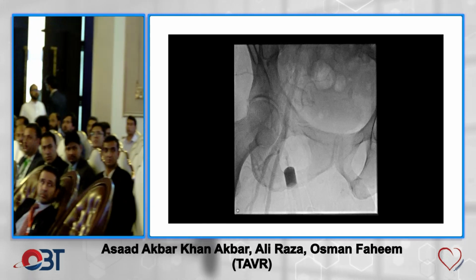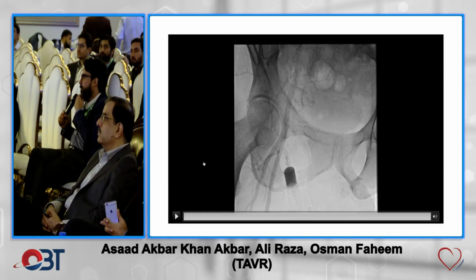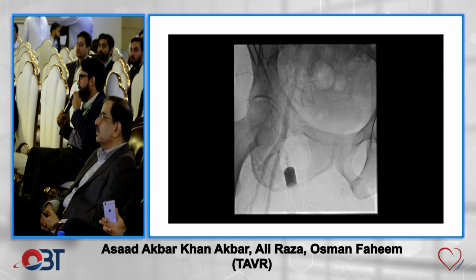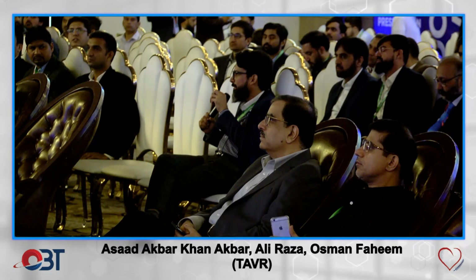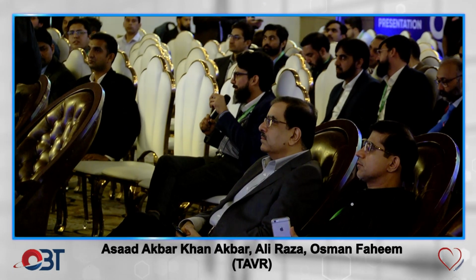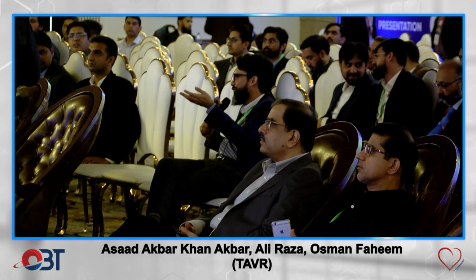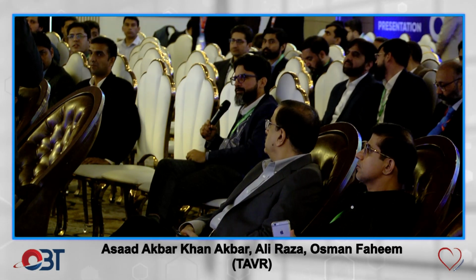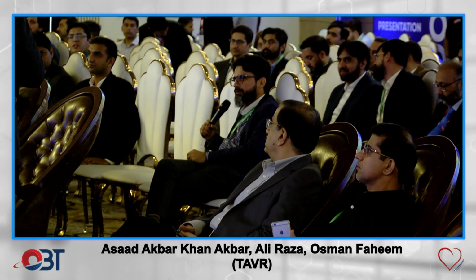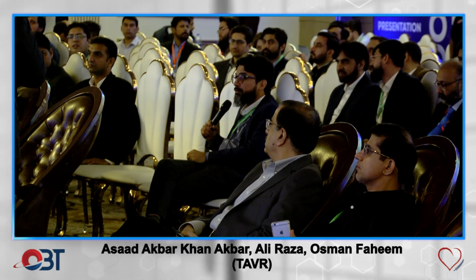Yeah. And a shortcut to micropuncture is to use your radial access sheath. Okay, your radial access needle, use that. Yeah. That's a lot more forgiving. And yes, you can then put your 4 French sheath in, but for access. Can 4 French, that wire which we use for the radial, 4 French goes through it, it should go through it, is it? It is okay, is it?